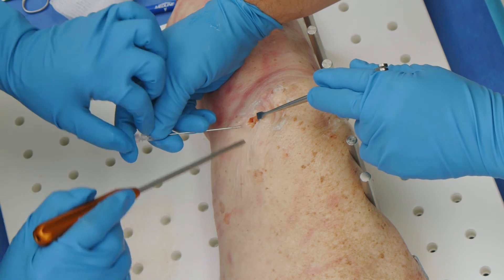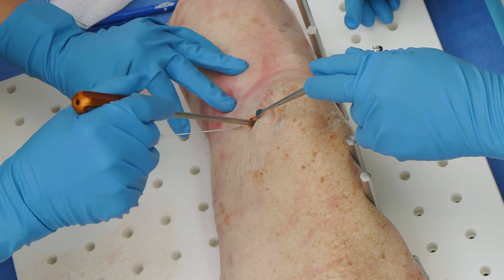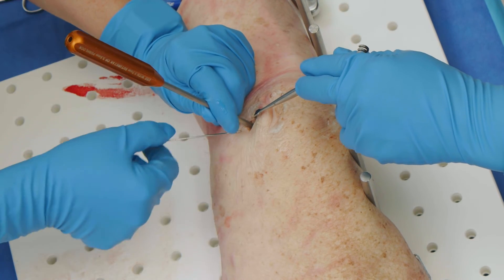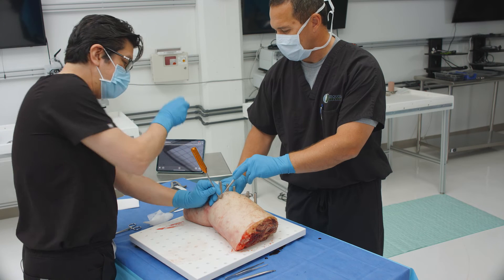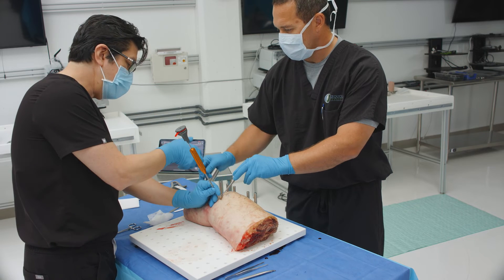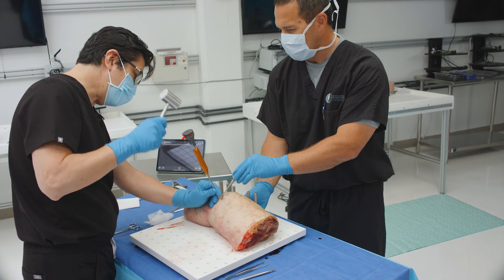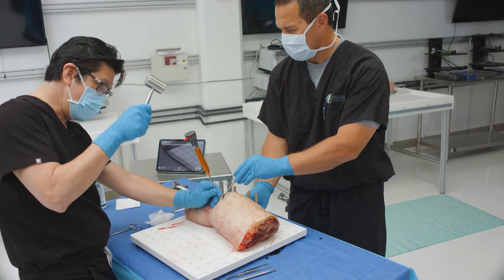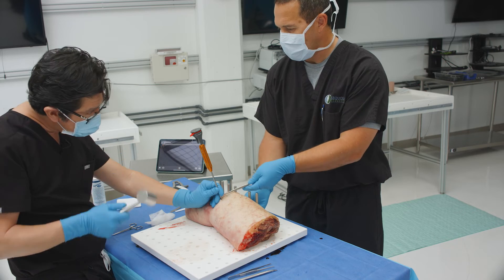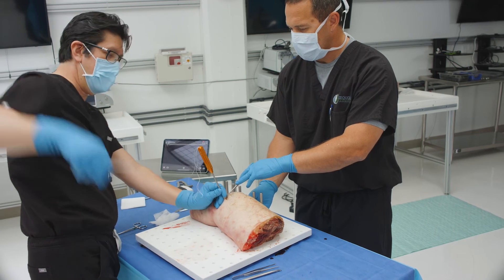This is going to be a knotless anchor. I'm going to place a guide at the location where I can clearly see the needle, basically at that position. I'm now going to get my punching knotless anchor and simply punch it in — you can drill first if you want. We're down, and the anchor is in. We're going to set it.